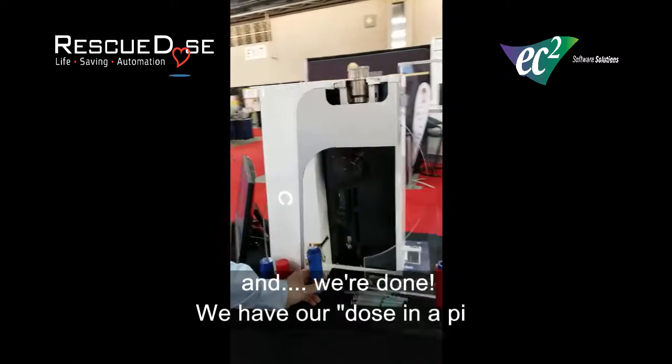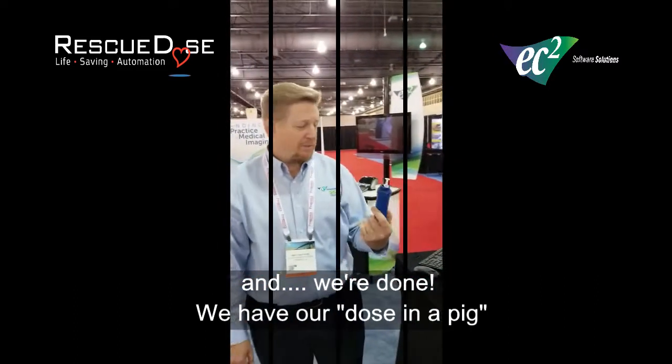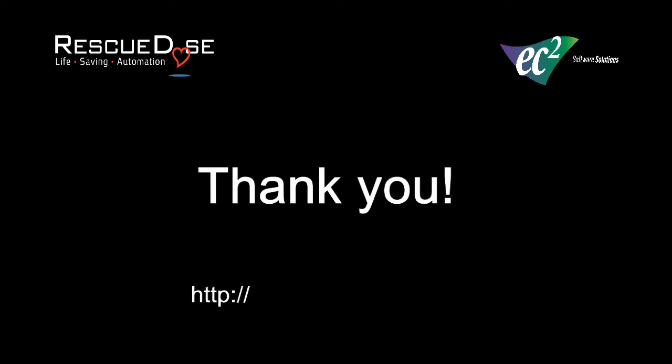And we're done. We have our dose in a pig. Thank you.